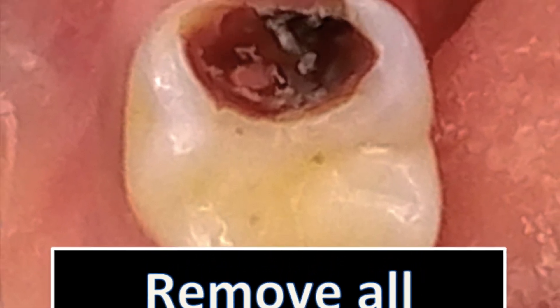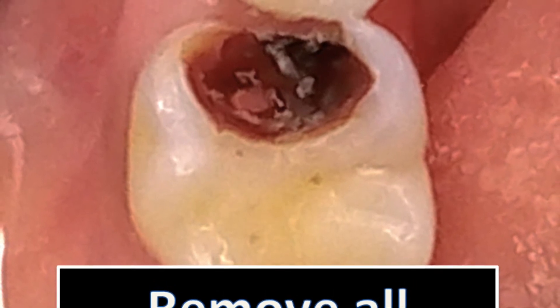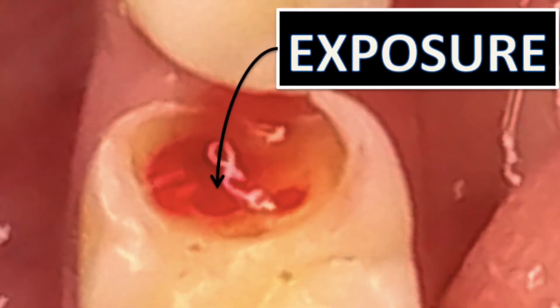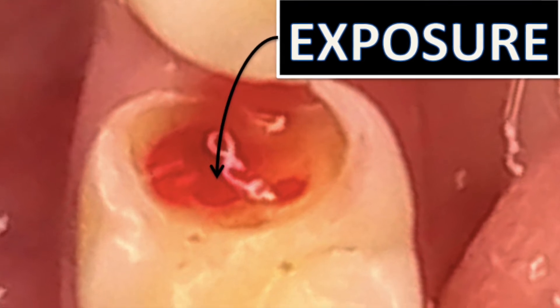At the end of caries excavation, you increase the visibility and also the probability of discovering the connection between the caries and the pulp chamber.